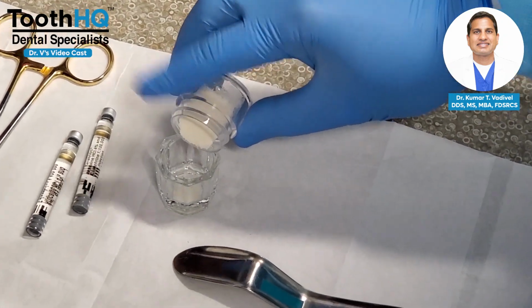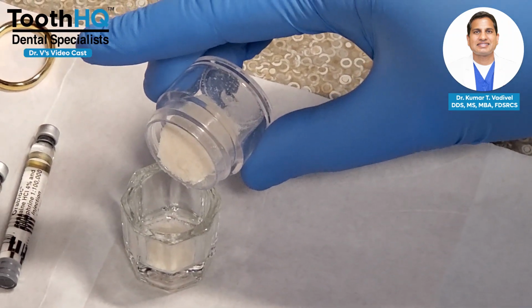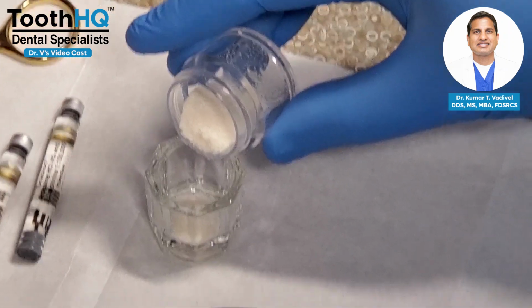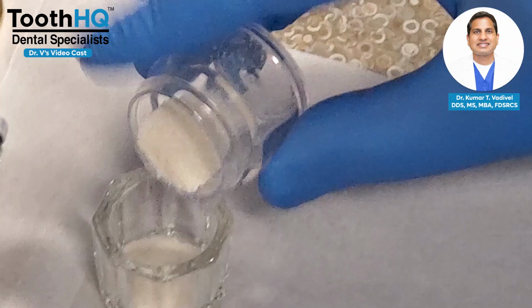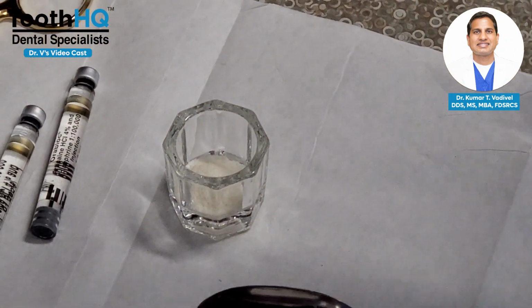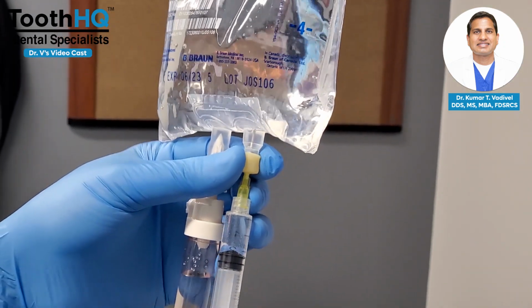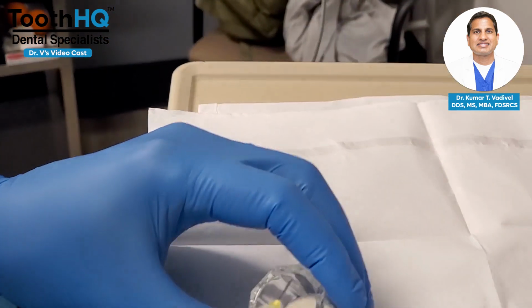So make sure that however much bone you guys are going to need, pick the particular vial. It comes in different sizes, I believe 0.5, 1 and 2 cc. So talk to your rep and see which size you really want. So I'm going to pour the bone here. After I pour this, I'm going to keep the rest of the bone if needed for finishing up the procedure. Because in this case I'm doing it under IV, I'm going to draw some saline from the bag, and I'm going to use that to hydrate the bone.